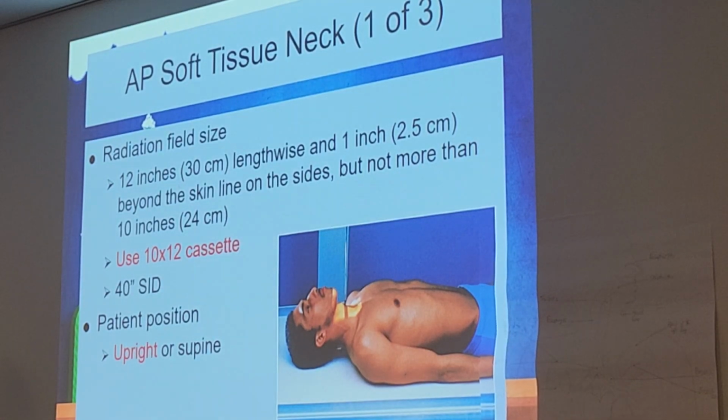How does using a bigger cassette affect the image again? So we just bring the overall quality down. And really it's because of human error, laziness. Let me put it this way, the bigger your cassette, the more likely you're just to leave it open. Whereas a smaller cassette kind of forces you to do what? Collimate down to that minimum size. So it's a safety thing, and it's really a quality thing as well.